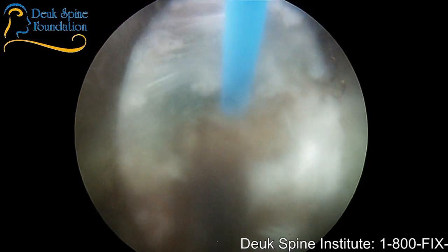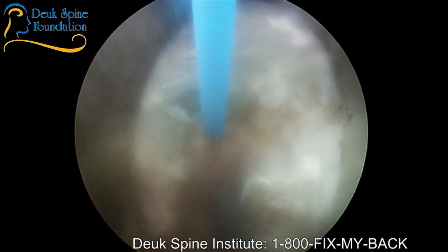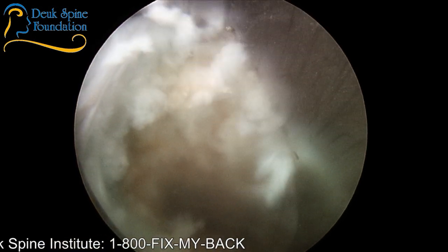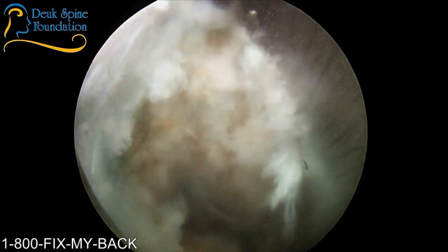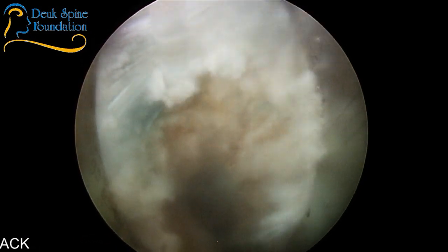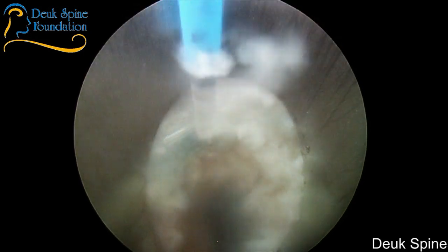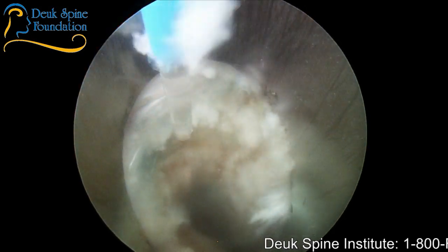We have a question. Sure. We have a viewer asking, is this type of surgery always considered to be the best option? So the answer is it depends on what we're treating. If we're treating cancer, it's not the best option, unless the cancer is right in the foramen in the back of the disc. If we're treating deformity where the spine is falling apart and needs screws and rods, this is not the best option.